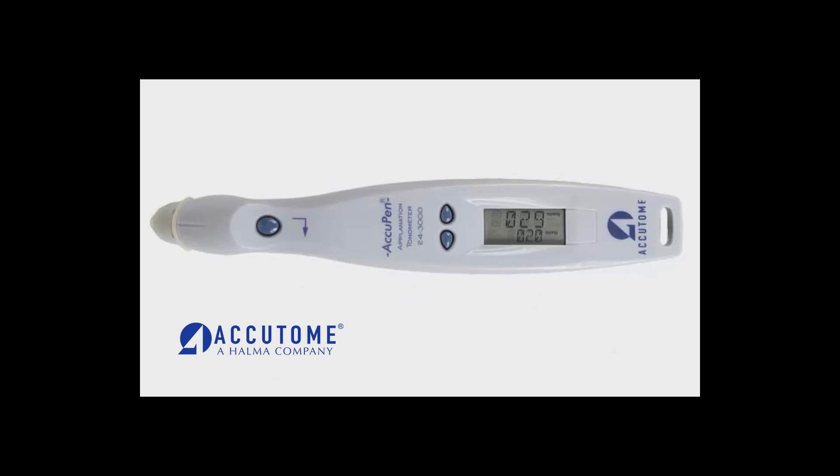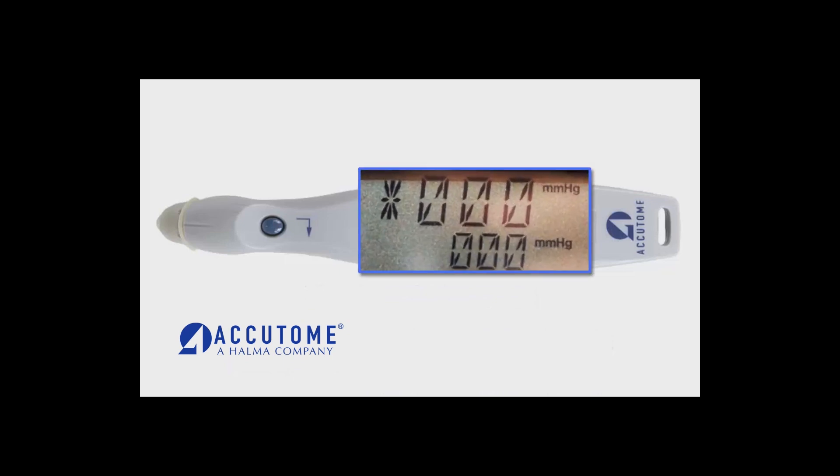To clear the AccuPen completely, hold down both arrow buttons for approximately three seconds. The unit will chirp indicating the measurements have been deleted. Once six zeros appear on the screen, the unit is ready to acquire a new measurement.